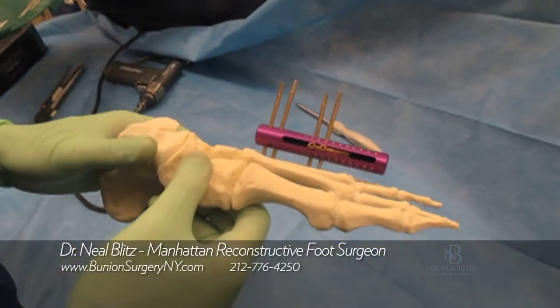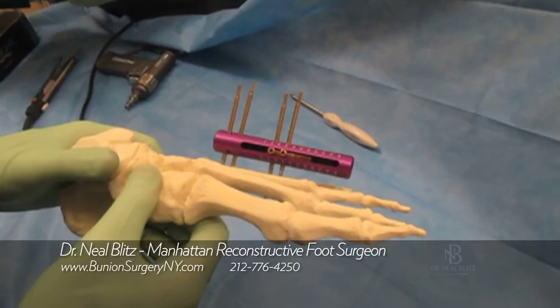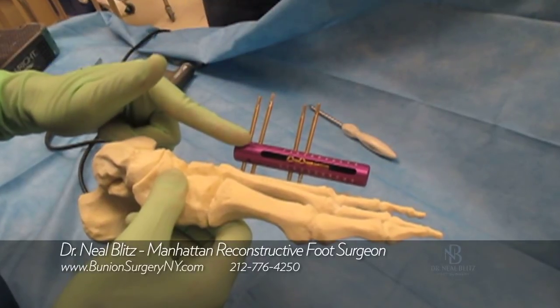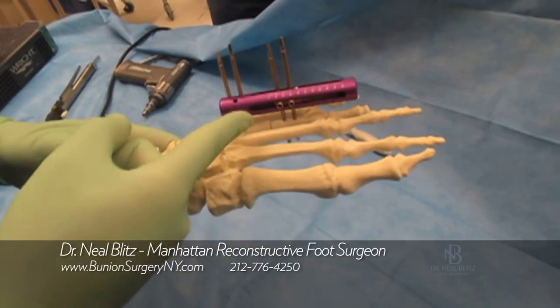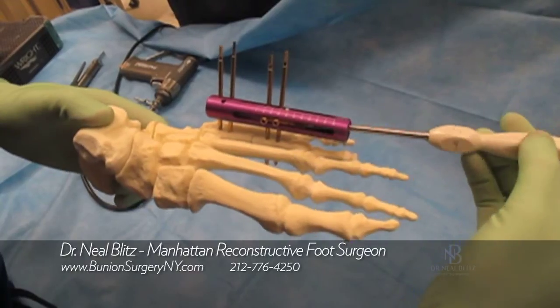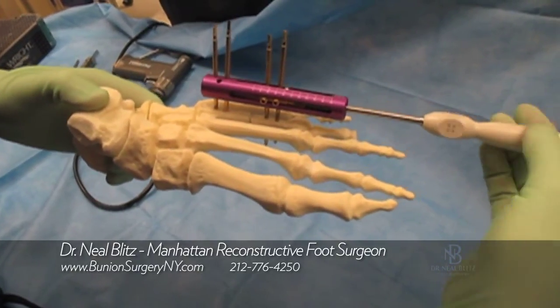So this is the final view of an external fixator placed on for brachymetatarsia, or a short fourth toe. These pins go into the bone directly, and this is the fixator that distracts the toe. You can see that's the bone cut, and what we're going to do is rotate this, and you can see the bone separating.